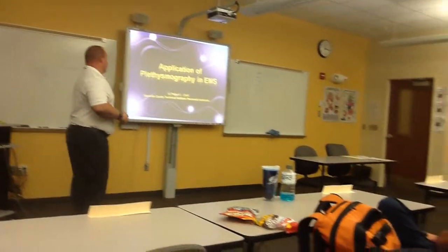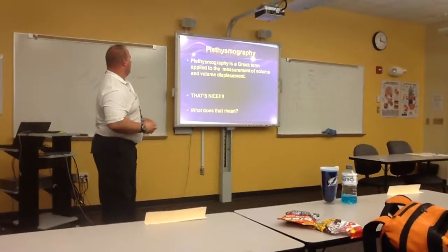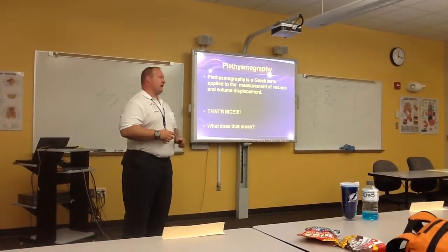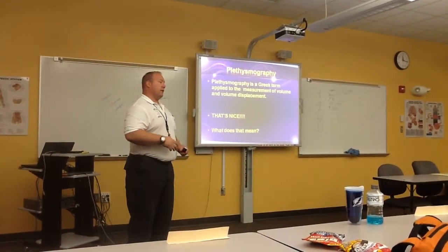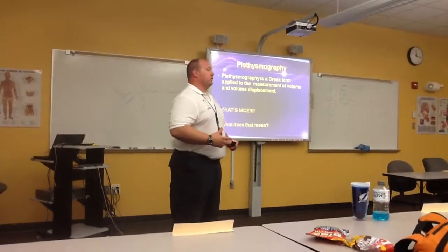Today we're going to be discussing the application of plethysmography in EMS. Plethysmography is a Greek term applied to the measurement of volume and volume displacement. That's nice. It doesn't really mean anything to us, all right? What it does mean is what I'm going to talk about. For the rest of this lecture, I'm going to use the term pleth.